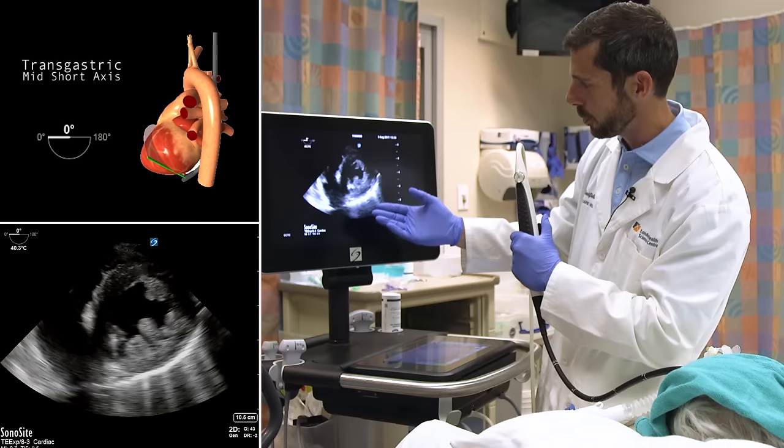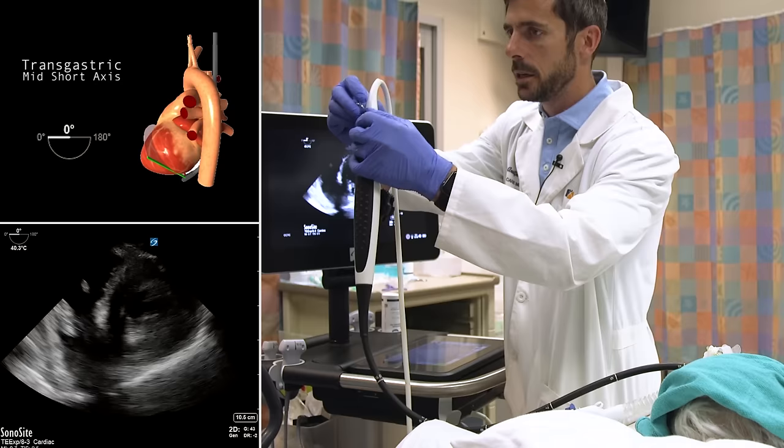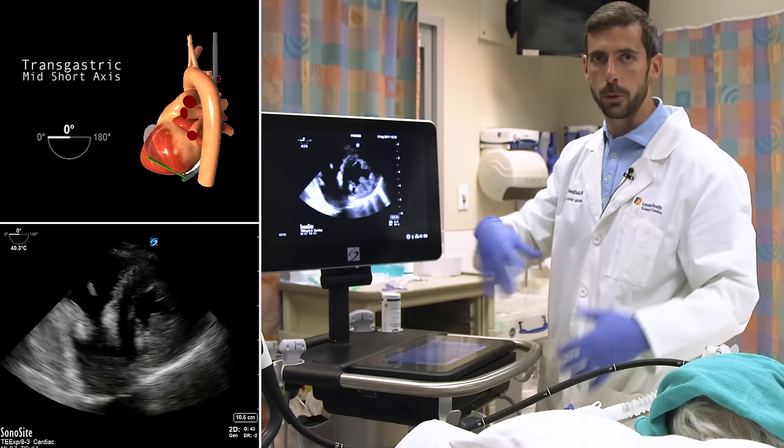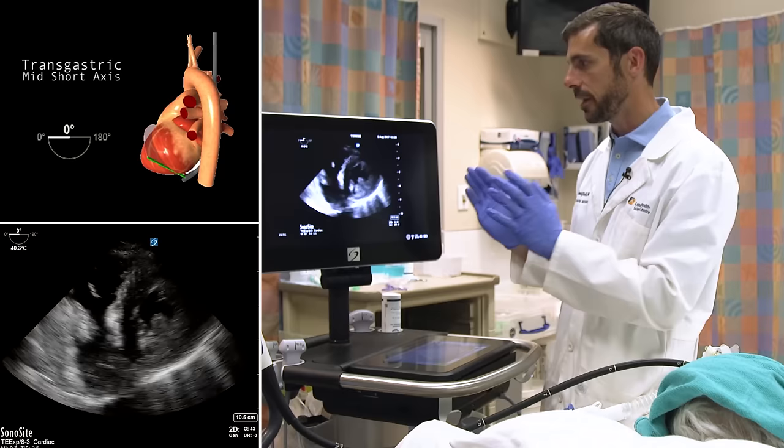We can see that LV function is generally preserved, except for the septum which appears a bit hypokinetic. We can then lock the probe in this position and set it on an IV pole, giving us an anatomic monitor during resuscitation — we can carry on managing the patient while always having an echocardiogram to defer to in real time. That concludes the four-view goal-directed approach we endorse for quick resuscitative questions and shock differentiation.